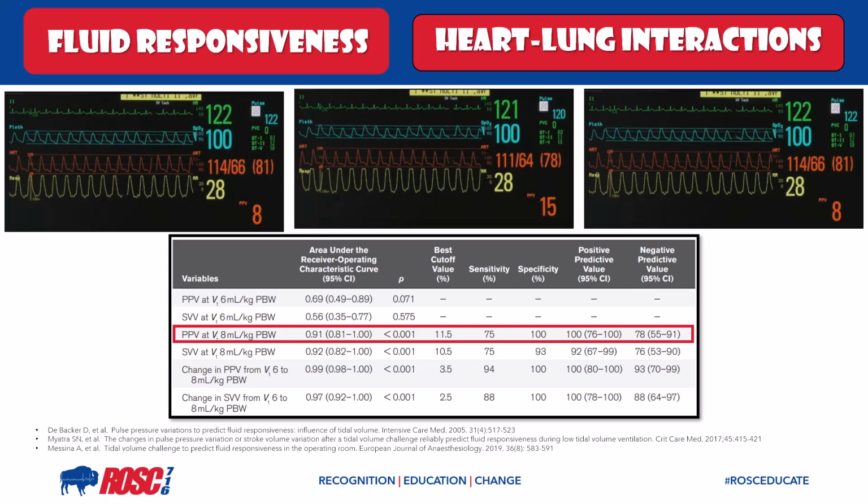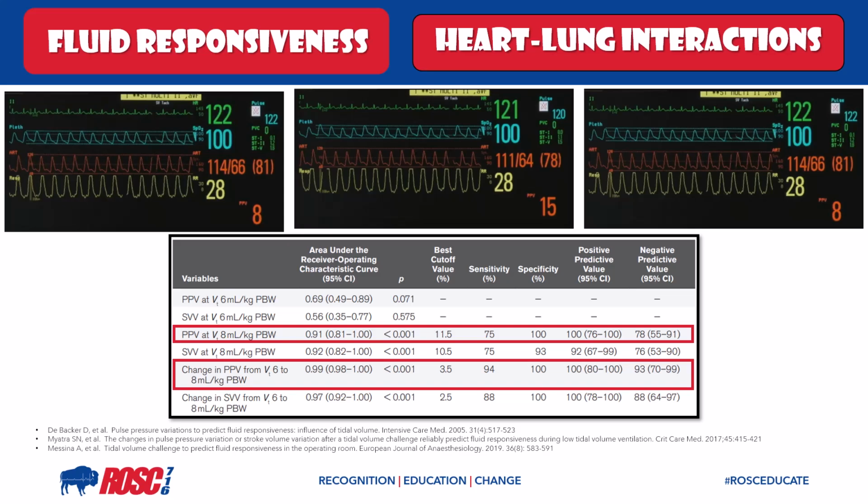What seems even more important is the difference between these two provoked tests. That is the pulse pressure variation of 8 and the pulse pressure variation of 15. The difference is 7. So what we see here, if you have a change from your tidal volume from 6 mLs to 8 mLs, and you have a cutoff value greater than 3.5, you can increase the sensitivity to 94% with a positive predictive value of 100%. In this example, you see that the patient easily met this threshold, has a 7% difference, which is greater than the 3.5. This patient is a fluid responder.